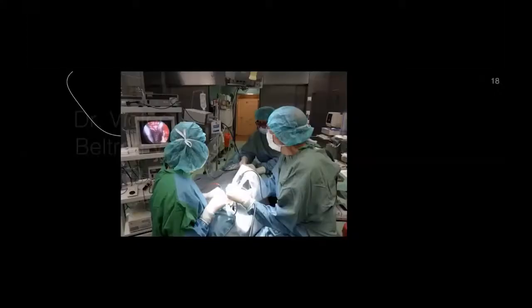The assistant on the left side of the picture is positioned parallel to the operator and performs separation and suction functions to allow for an image which is clean of pollution.